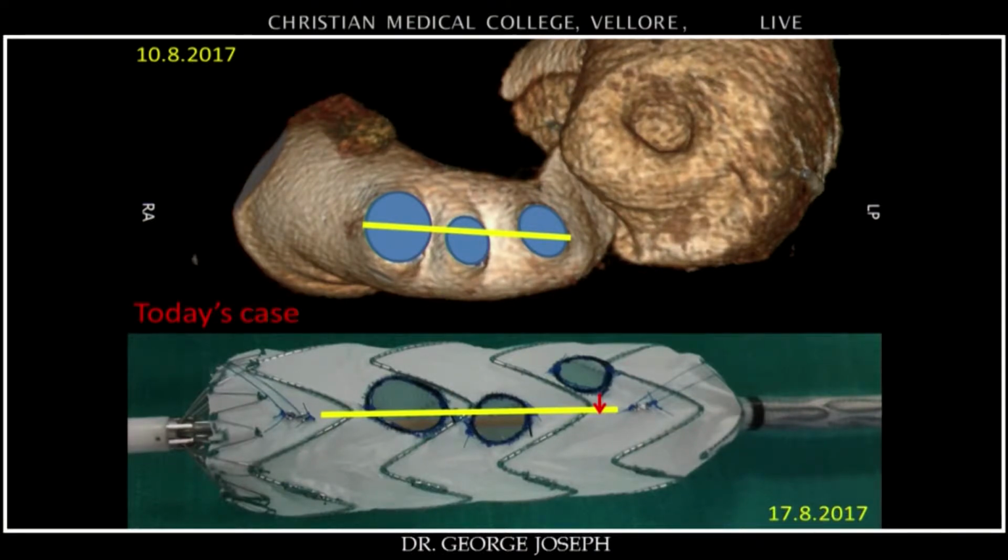The bottom panel shows the graft that we are going to use today. We made 3 fenestrations, approximately the same location and distance as what the CT showed us. But you can see that the left subclavian fenestration had to go a little posterior because it had to avoid that strut. We don't like to make a fenestration over a strut. So to avoid the strut, we had to push that one a little back. We hope that that will not create too much of a problem canalizing it.